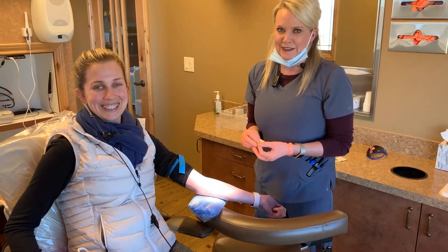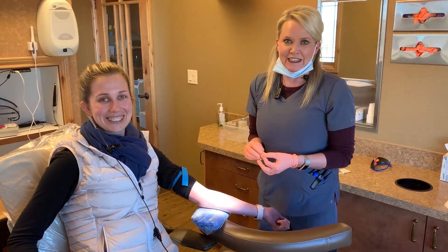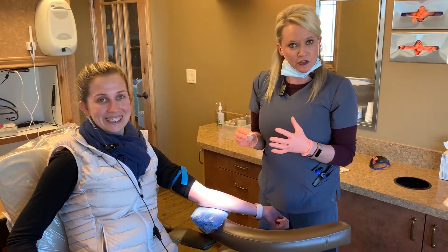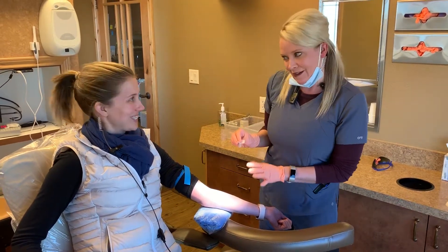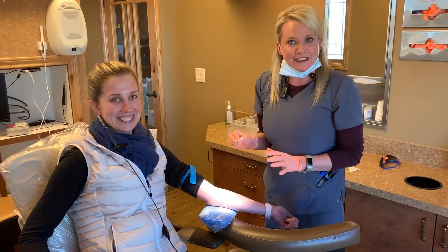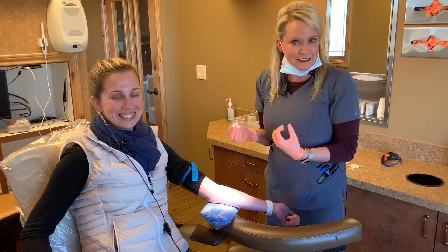Hi y'all, it's Bobby and Tara here from Greeley Dental Care. We're just going to kind of show you some of our surgical things we do here. I'm going to draw a little bit of blood here on Bobby, our wonderful volunteer, and then we're going to spin it down and show you what happens from that.